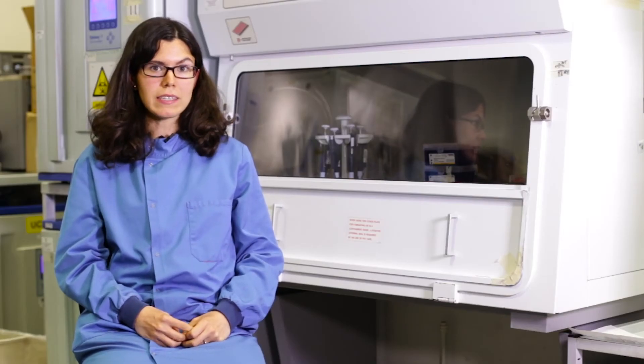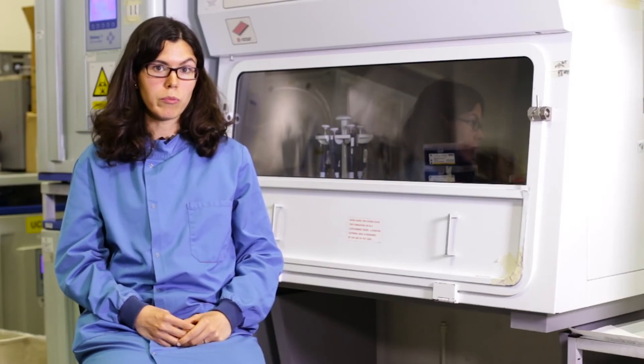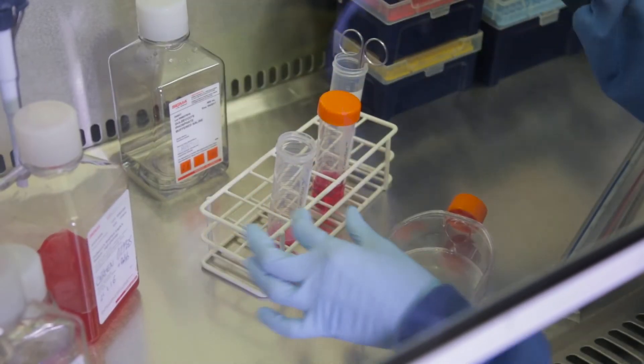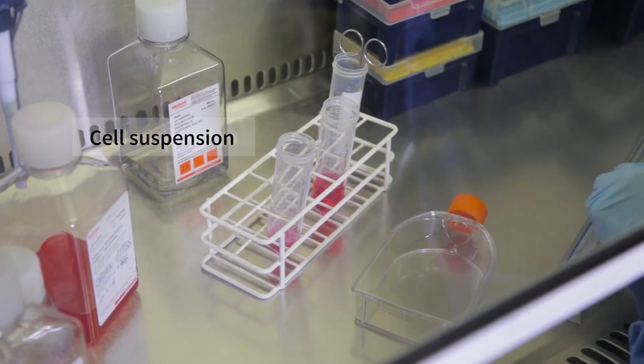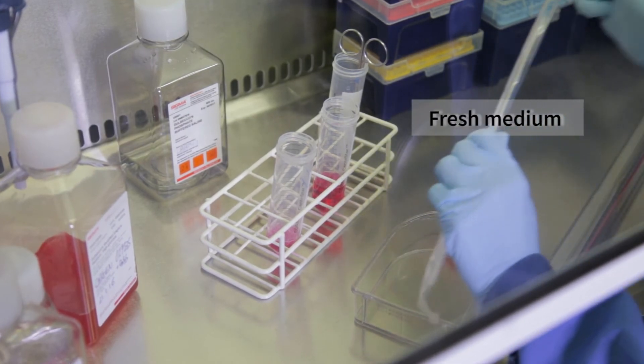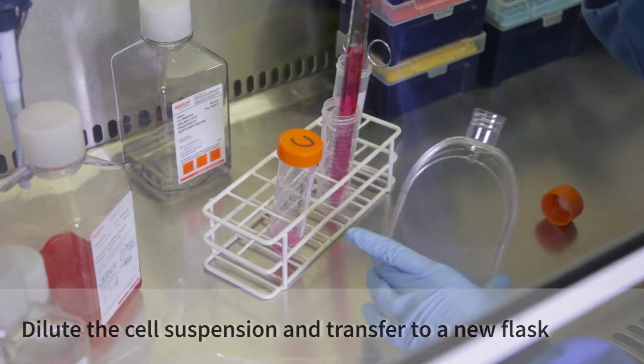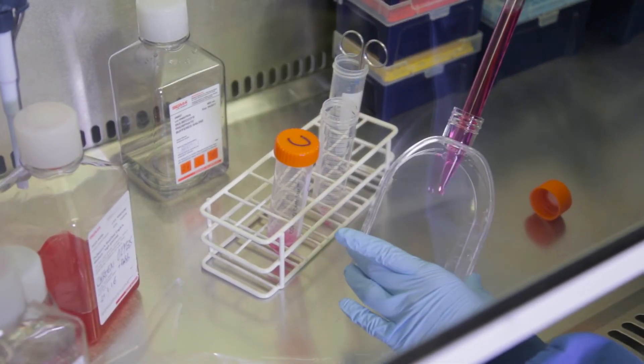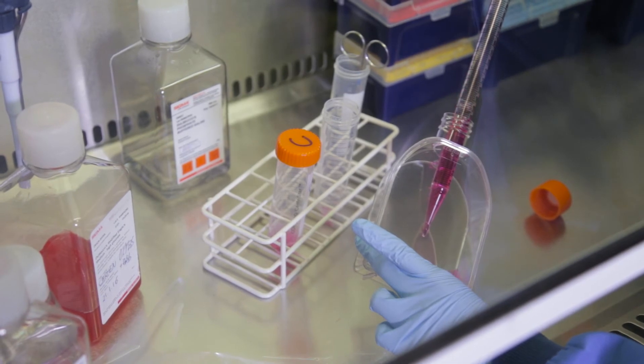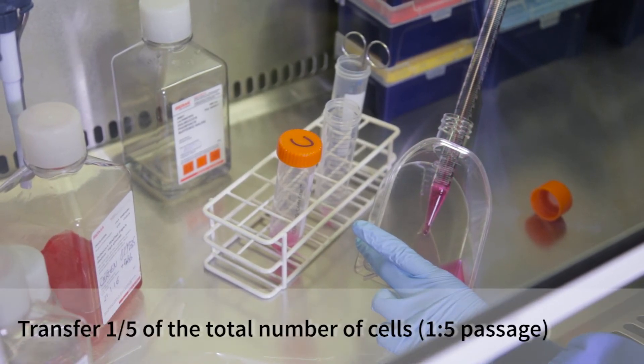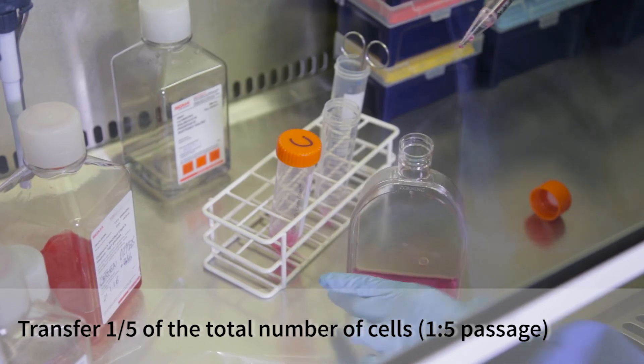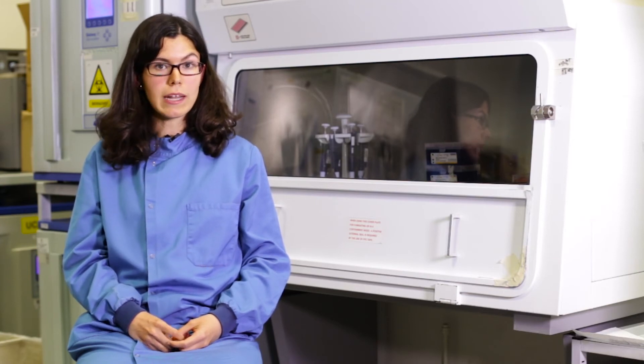I want to keep my cells growing so I can use them again the following week. I will now prepare a dilution of the cell suspension using fresh culture media and put it in a new flask. This is called passaging cells. I will make a 1 into 5 passage. That means I will take one-fifth of the total volume of cells into the flask. I will now put the cells in the incubator at 37 degrees.